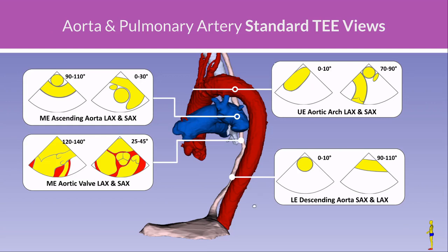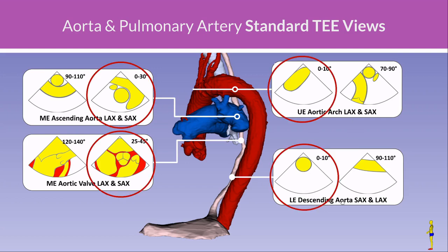Here are the basic TEE views for assessing the aorta and PA — four sets of long and short axis pairs. We have the mid-esophageal long and short axis views of the aortic valve, the mid-esophageal ascending aorta long and short axis views (which also show the PA), the upper esophageal arch views, and views of the descending aorta from upper to lower esophagus. You can get most information with just four views by keeping the probe near zero degrees and scanning through the entire aorta — a screening exam can be done in under a minute.